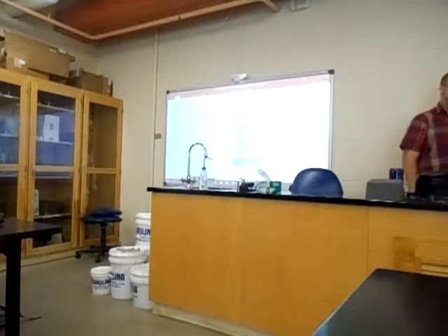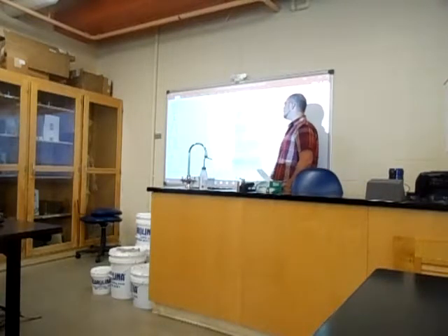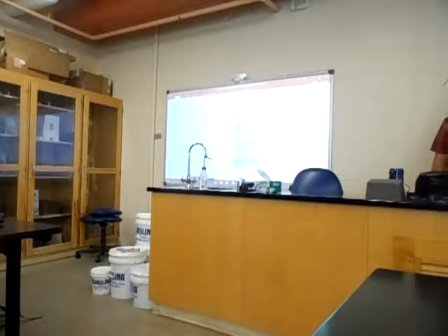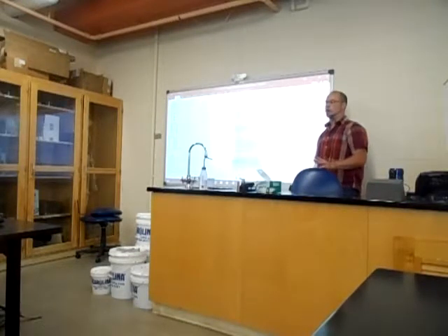And that looks good. The next one down here on the bottom says junctional rhythm. We used that term a second ago. Junctional rhythm is what you call it when what is happening? Right. So we have a non-functional SA node. The AV node has got to take over the work. And that's what's happening. Now, we already said we knew one thing would happen from the AV node having to take over. That's what?